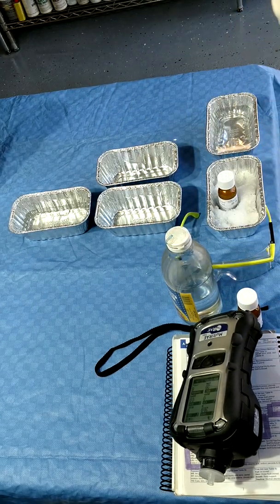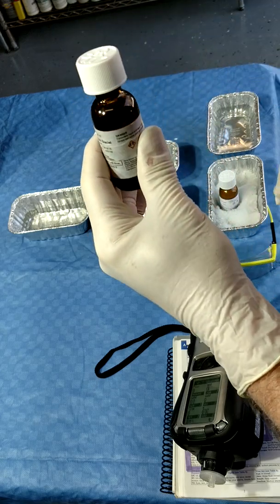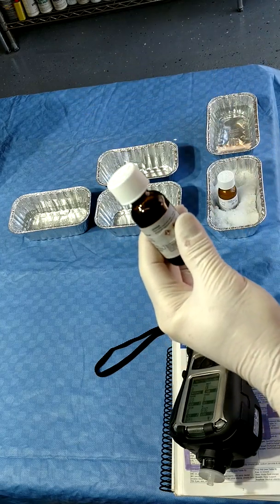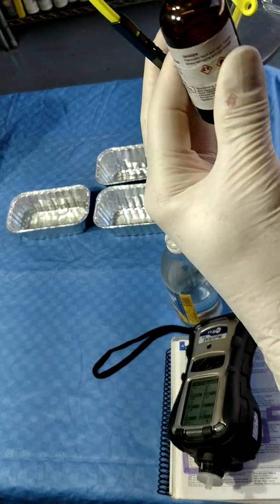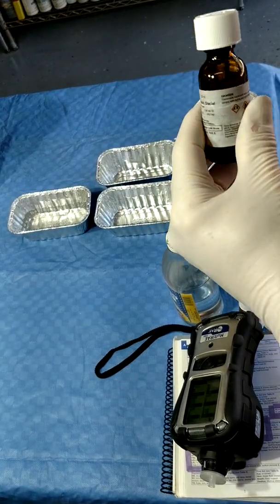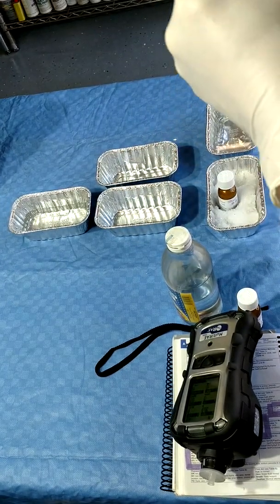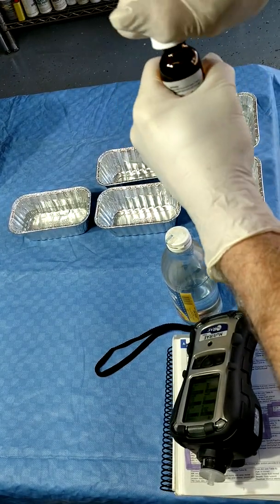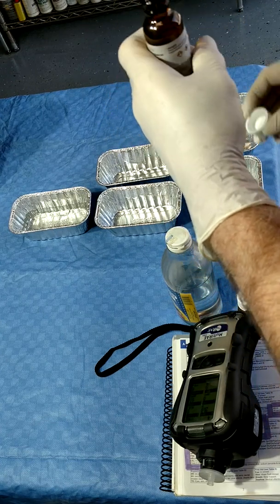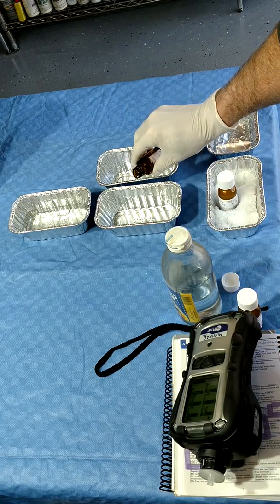Putting some of the warm glacial acetic acid, I'll get the glasses on first. Using the warm glacial acetic acid, please only use this in a well-ventilated place. We'll pour some of that into this sample here.